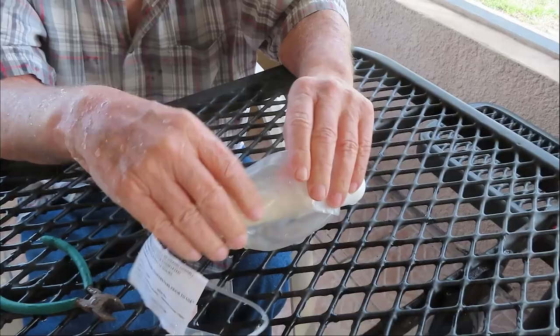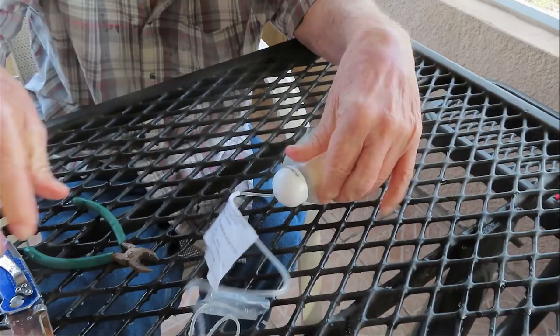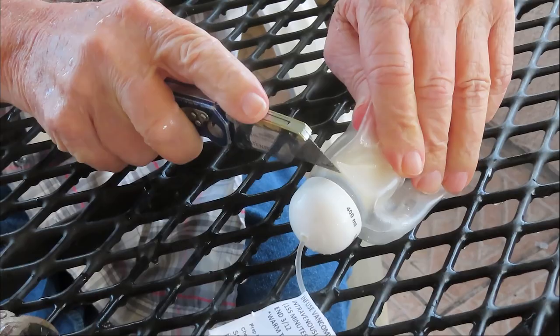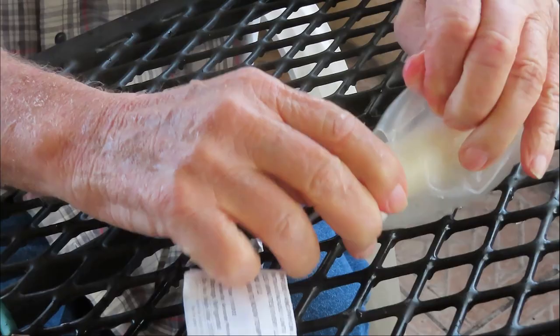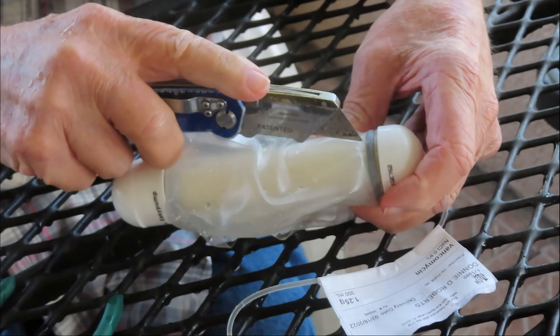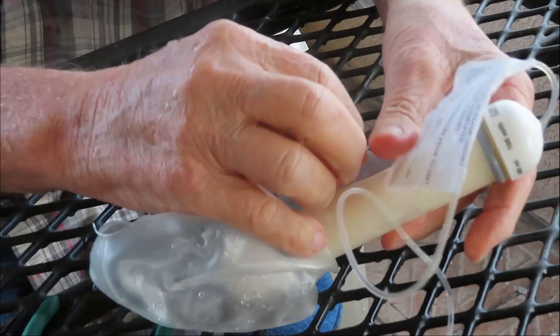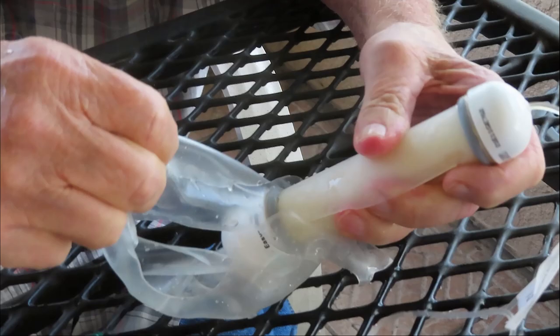Never opened one of these before, so this is new. Yeah, here's the internal bag. You can see exactly, when I popped it, it popped. And this is more stretchy. This is stiffer. So when this stretches and hits this bag, it can't fill anymore.